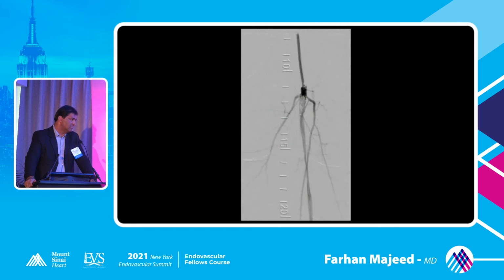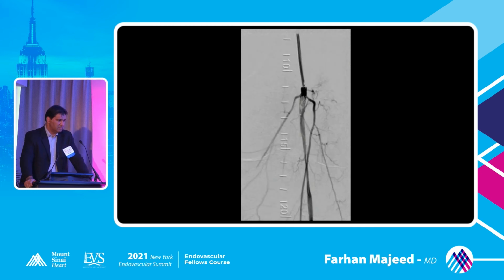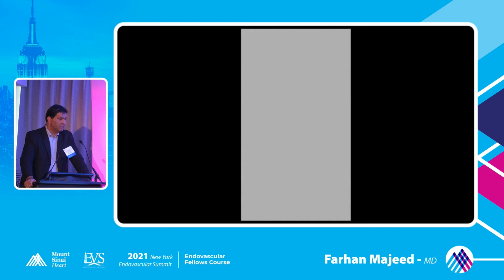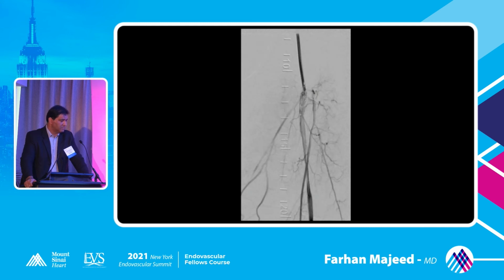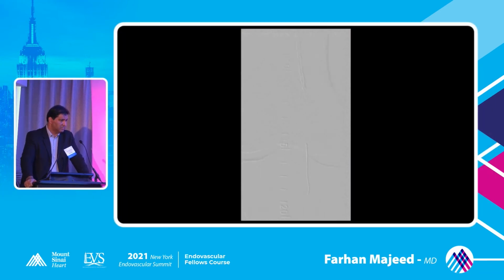Well, if you fill the filter, it's like a carotid intervention, right? You could spill. Unlike a carotid, thank goodness you're not going to get a stroke here, but at the same time, you could embolize and really create a major problem down below. So you have to be able to manage the filter as well as aspirate the filter. You cannot just capture the filter if it's full of clot. You will embolize. Yep, it's going to overspill.